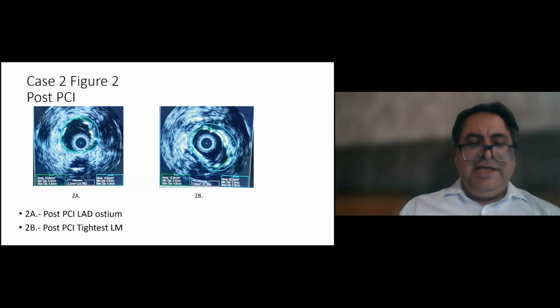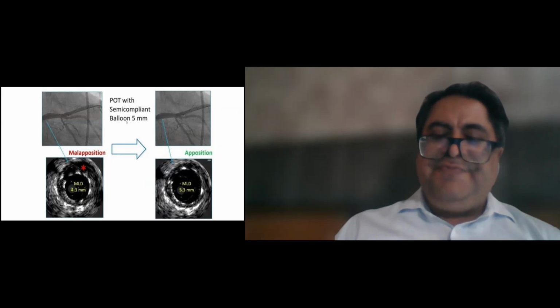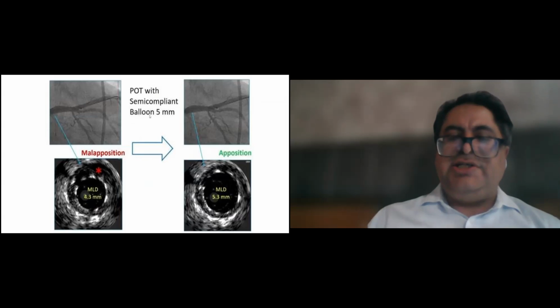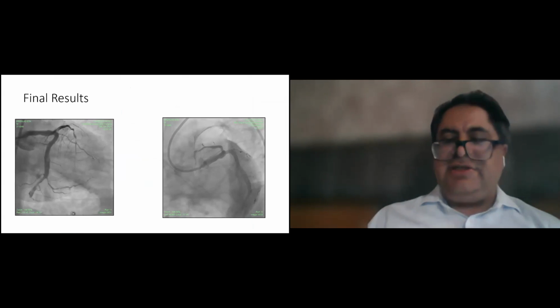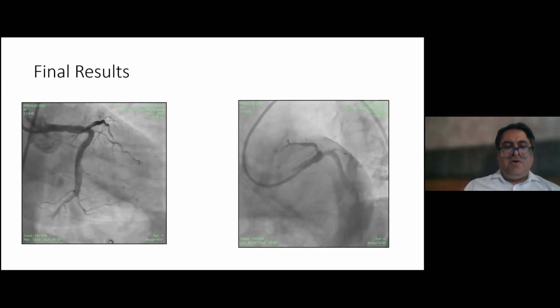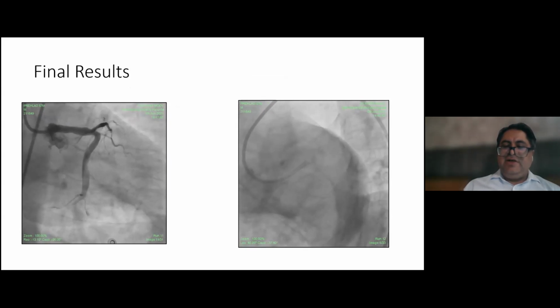So post PCI, good LAD ostium. We still saw there was malapposition, which was corrected with the POT with the semi-compliant balloon, and this was the final result. You can see very well apposed stents in all the vessels, good flowing LAD, good flowing circumflex, good carina.